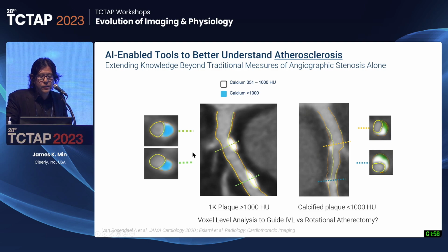I think that because you can start to get the geometry, and not only the geometry, but the density of the plaque, you can imagine that if you had somebody with a subtotal occlusion, that you were thinking about doing intravascular lithotripsy versus rotational atherectomy, and how that can influence whether or not you can find a portion of this lesion that has like a weak spot that maybe you'd hyperinflate a balloon and start there with your procedure to try to help facilitate it.